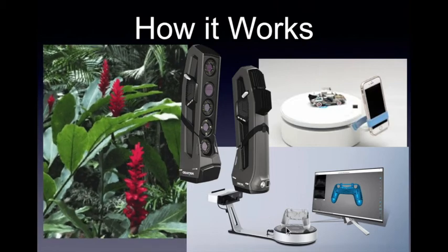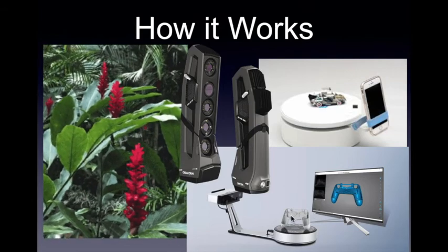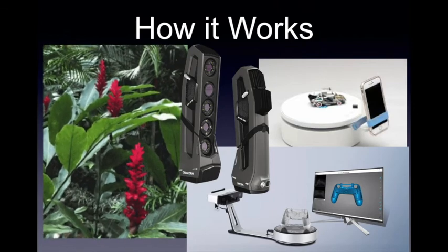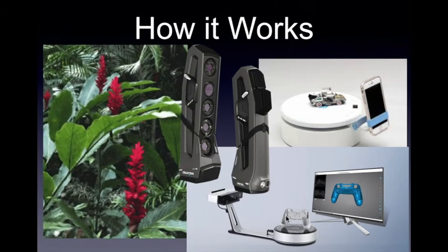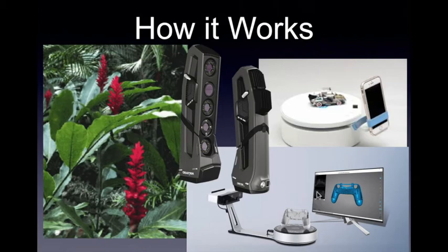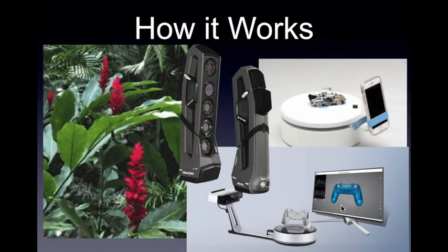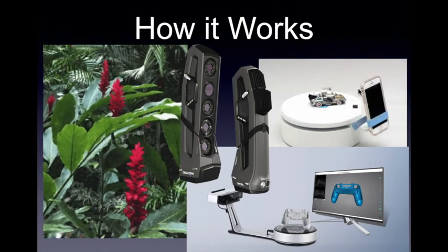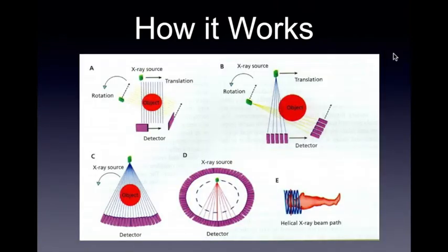So it's oftentimes in a jig like this where the scanner or the object moves. This would be a turntable that would move your object, allowing the camera to actually take a picture of every side of that 3D object and then transmit it, reformat it to an actual 3D image or picture. We see a lot of DIYs where cameras could actually be placed on a jig in order to do the same thing. Now, this comes not as a new technology, but as something that has already been used before.